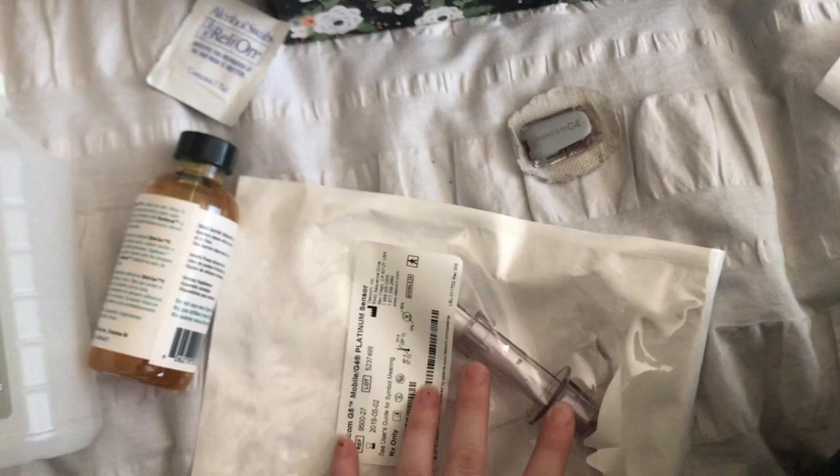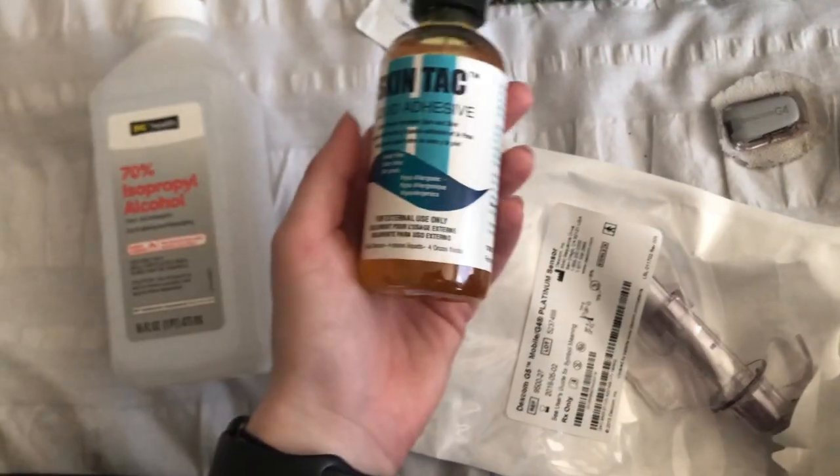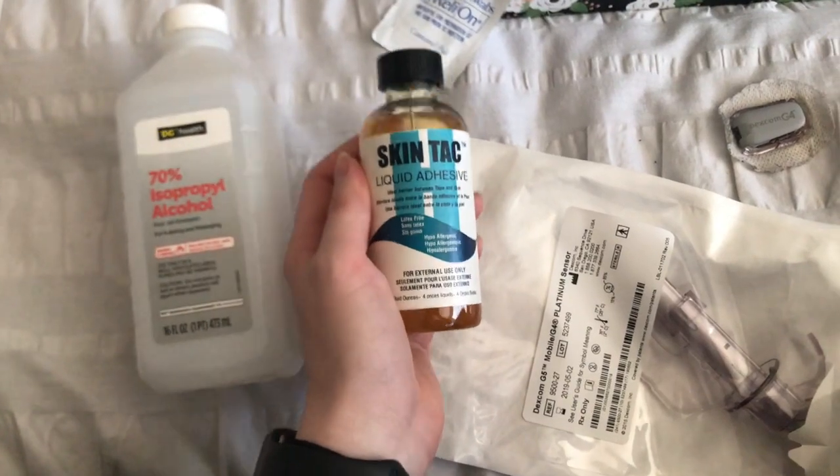Left arm is my favorite but I can't put one on top of it — I'll have skin breakdown — so my next one's going to go in my right arm. For the CGM change I'm going to need the CGM sensor and installer, Skin Tac liquid adhesive, alcohol prep pads, and alcohol. When I first started using my CGM it would come off within five or six days. I found this amazing stuff on Amazon — it is the stickiest stuff ever — and that's how I'm able to make this last 14 days, which saves me money.